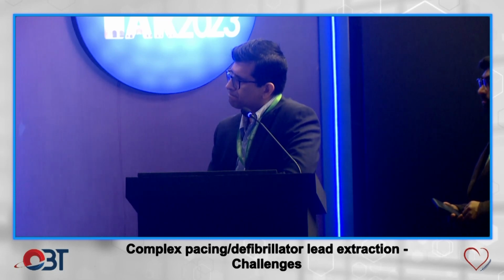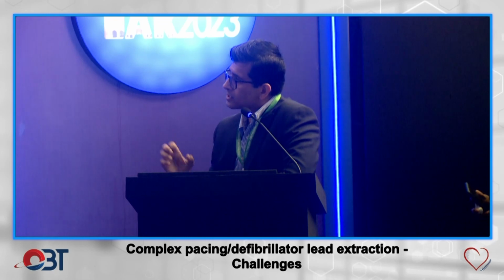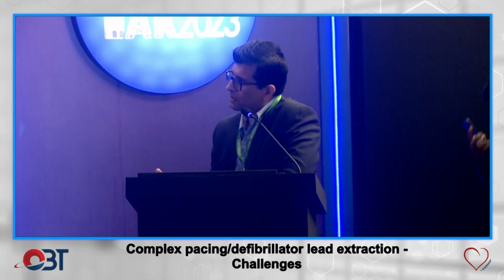Now coming to laser, I think I was introduced to hands-on laser way back in 1990, 91 for coronary problems. So is it the same laser that you use for coronary as well as lead extraction, or is it different? Sir, it is the same laser. It is the same console which is used for both purposes.